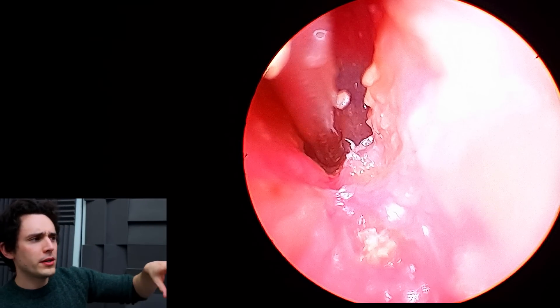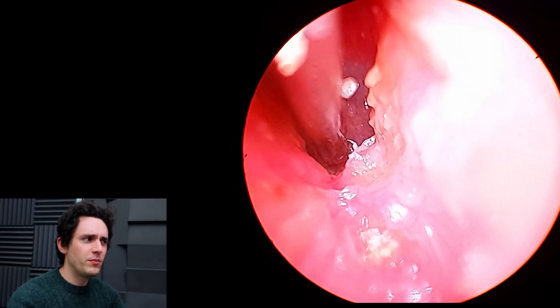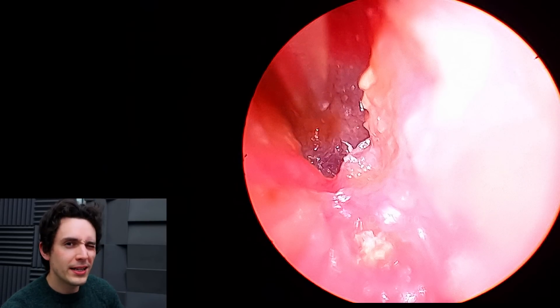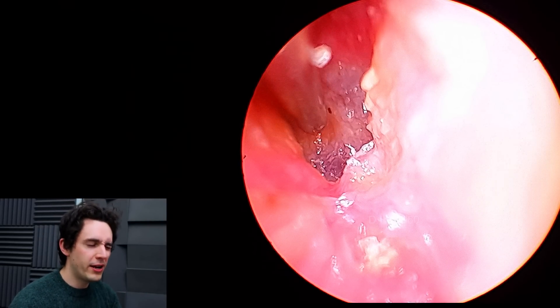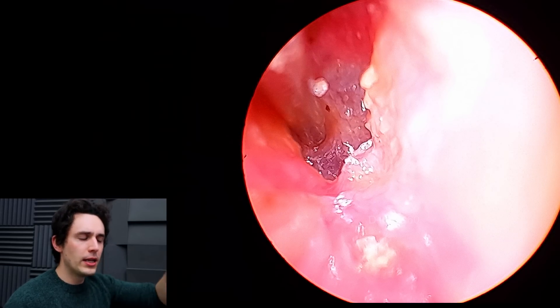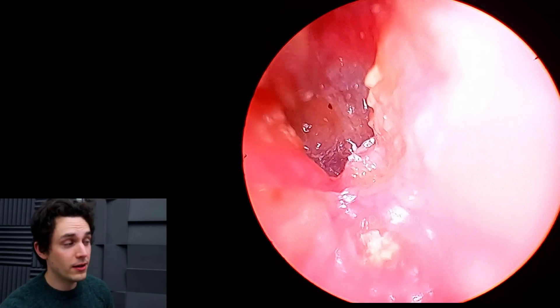Now you're probably thinking at this point: aren't canal cholesteatomas supposed to be huge collections of dead skin, similar to middle ear cholesteatomas but rarer? The reason that this one looks nice and neat is because most of the heavy lifting has been done for me the day earlier.